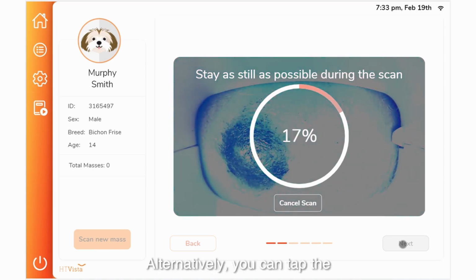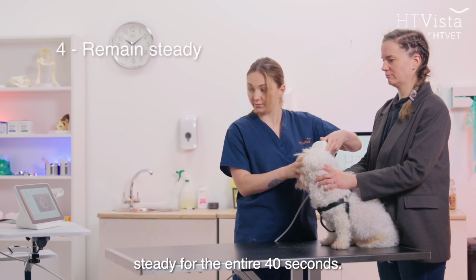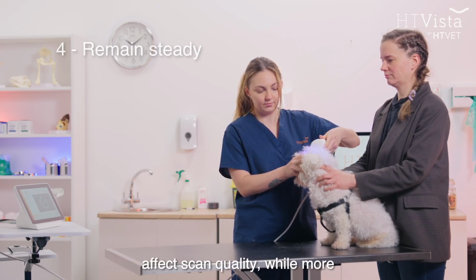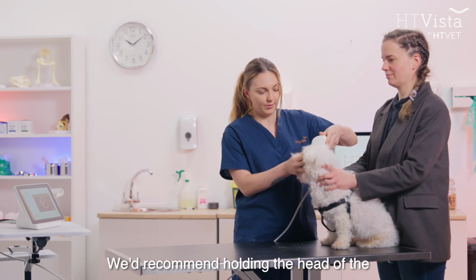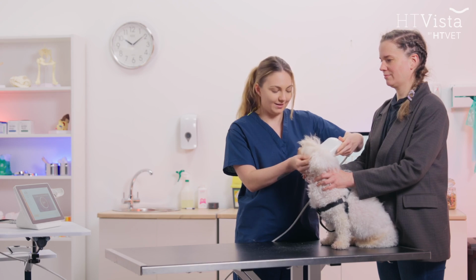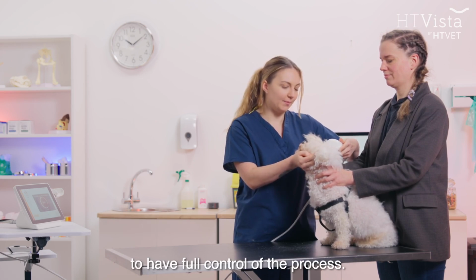Alternatively, you can tap the Start Scan icon on the screen. During the scan, it's important to keep steady for the entire 40 seconds. Small movements are tolerated but can affect scan quality, while more substantial movements can terminate the scan. We'd recommend holding the head of the scanner with your dominant hand and supporting the patient with your other hand. This will minimize movement and allow you to have full control of the process.